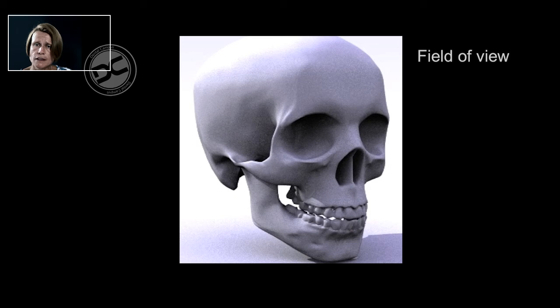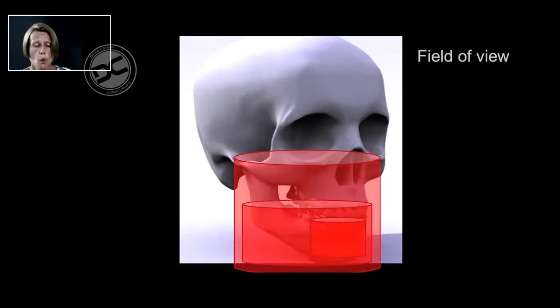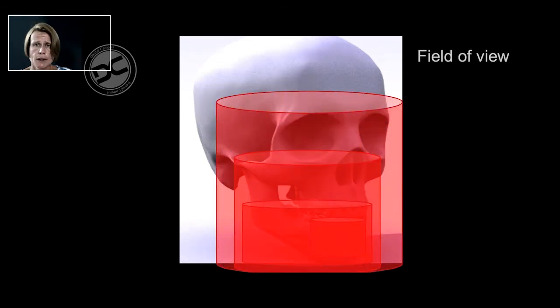The smaller the field of view, the smaller the voxels can be, and thus the higher the resolution. Bigger fields of view are sometimes useful to get an overview or even an exclusion diagnosis when it is not clear where the origin of the pain from a patient is coming from.